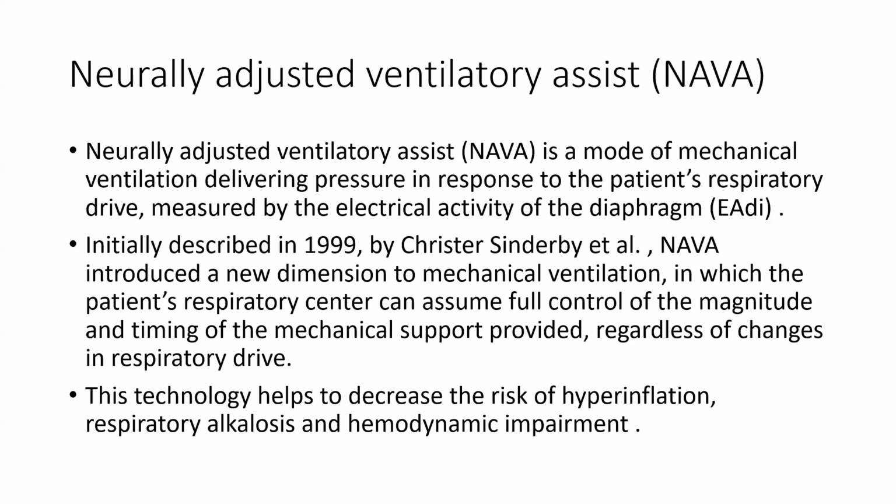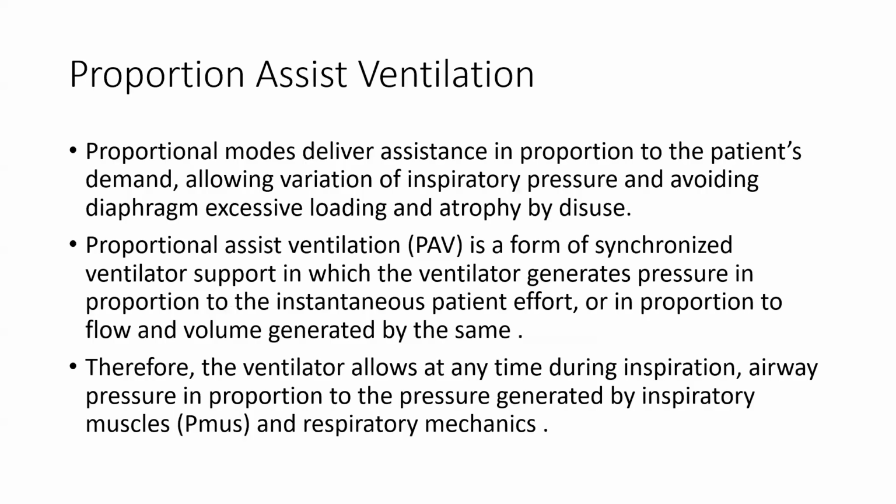Initially described in 1999, NAVA introduced a new dimension to mechanical ventilation in which the patient's respiratory center can assume full control of the magnitude and timing of the mechanical support provided, regardless of changes in the respiratory drive. This technology helps to decrease the risk of hyperinflation, respiratory alkalosis, and hemodynamic impairment. This is the schematic representation of NAVA.